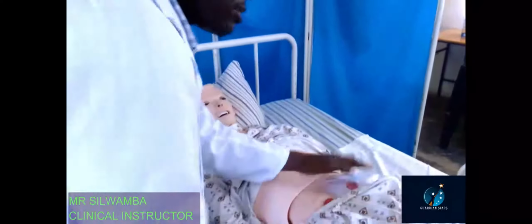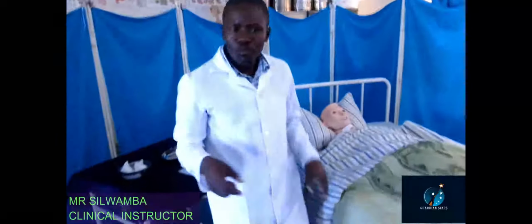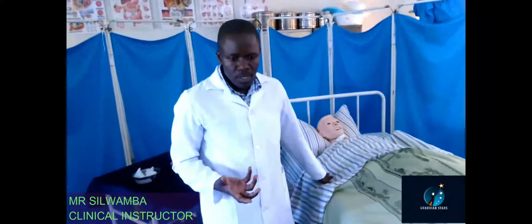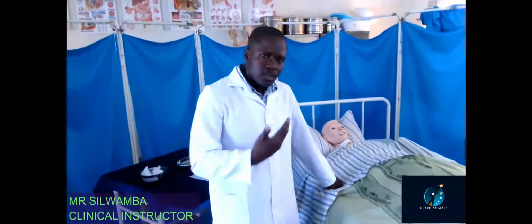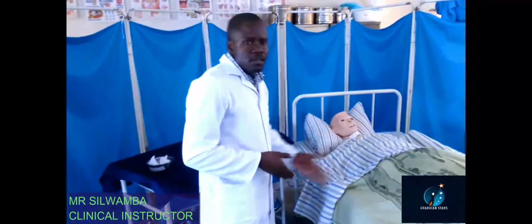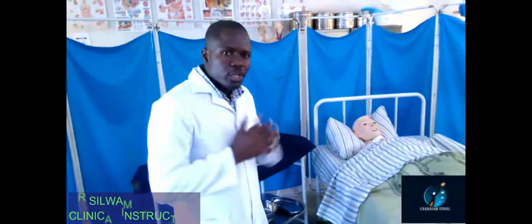If you look at your procedure manuals, they have two types. You can either do it on a colostomy which is active or a colostomy which is inactive. In our case, this colostomy is inactive. So what's the difference? If a colostomy is active, meaning fecal matter is coming out, the care we're going to give is a clean procedure. If the colostomy is not active, like in Mr. Mwila's case, it's supposed to be a sterile procedure. So those two differences should be borne in mind.